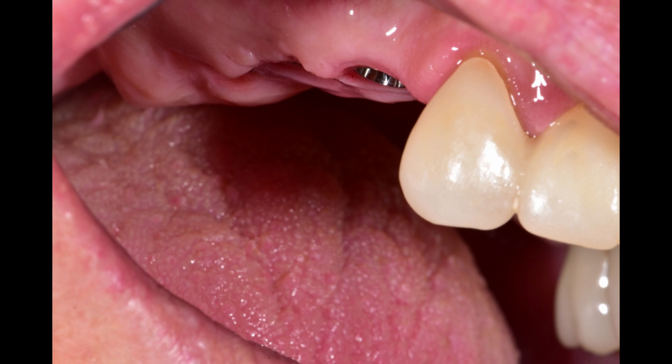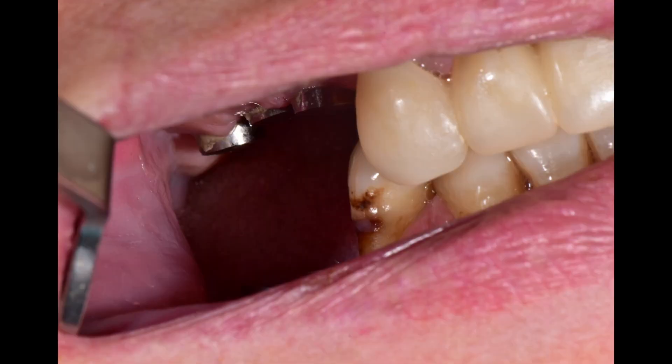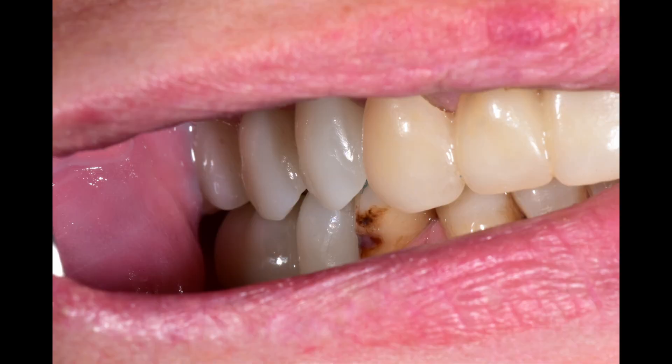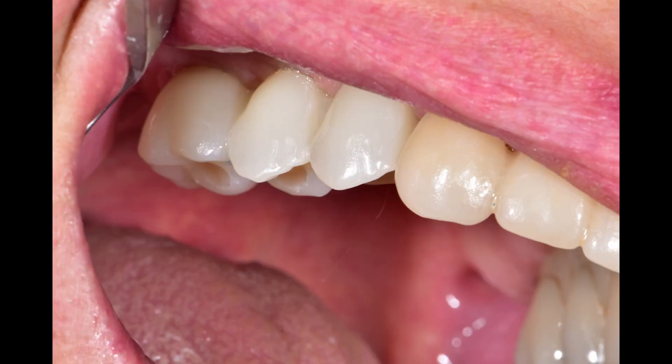Here are the clinical photos. Quad one — gums look happy. Quad four — there is a buccal lesion on the four-five that we ended up restoring. And then here are the implant bridges installed with the patient biting down. Quad four, and then quad one. Probably could have gone a shade darker, but the patient was happy.